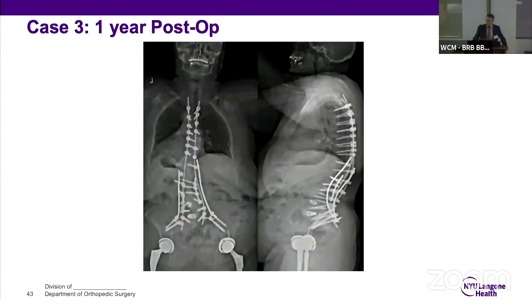And I think that one other thing that navigation is going to leap towards is intraoperative verification of our realignments. There's no reason why we can't use navigated instruments to, for example, on the fly, check an S1 screw and make that the new reference point, and then measure the position of the UIV, and we'll know exactly where that pelvic angle is relative to the UIV. So I think that'll be the future of robotics and navigation.